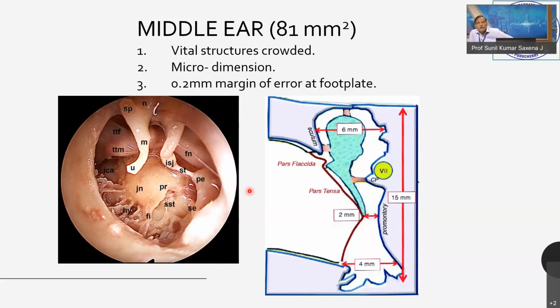Regarding the otoendoscope, to me, the ideal otoendoscope size is 4 mm. 4 mm, everywhere it is available. You can easily use it. To me, 2.7 mm is a little dangerous. When you are beginning, sharp instrument, lesser diameter, not to use. If the patient moves, you can damage the tympanic membrane. Use a wider diameter, and 4 mm is correct, which gives you a wider view rather than 2.7 mm. So 4 mm has to be used.